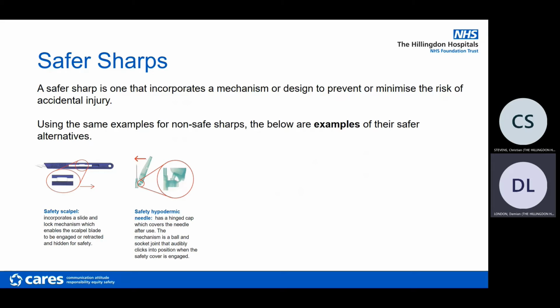Here we have a safety hypodermic needle with a cover. After use, the cover is activated by flipping it with our thumb, generally, or against a hard surface.